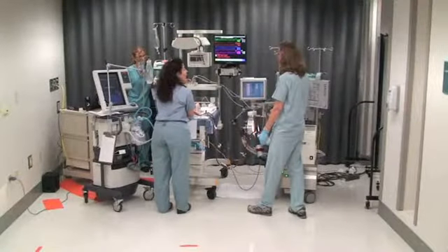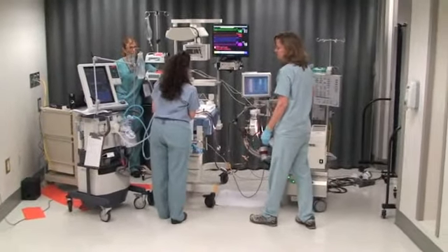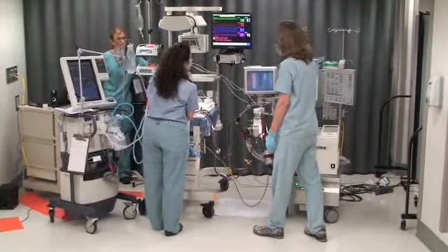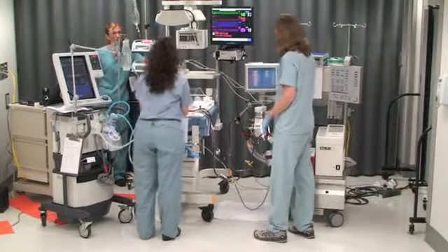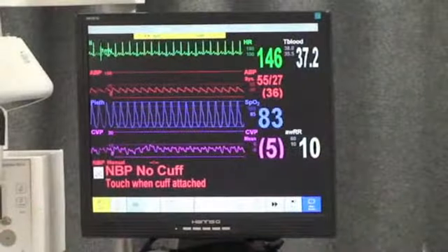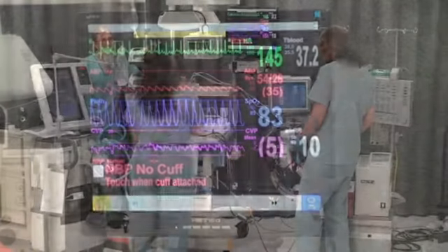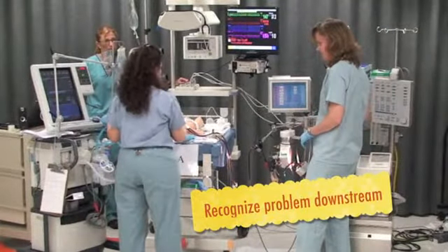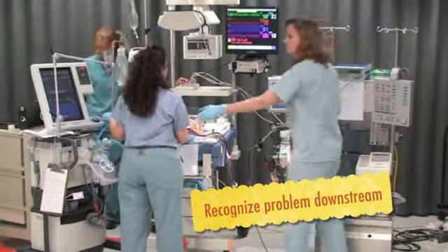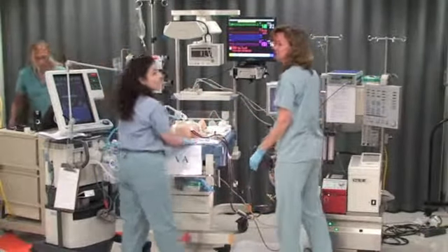Flow has dropped a lot — down to 150 of flow. The pressure's down and he's de-satting. I think we have some high post membrane flow pressure. Let's call the doc. Somebody call the ECMO doctor. We need another ECMO doctor in here.